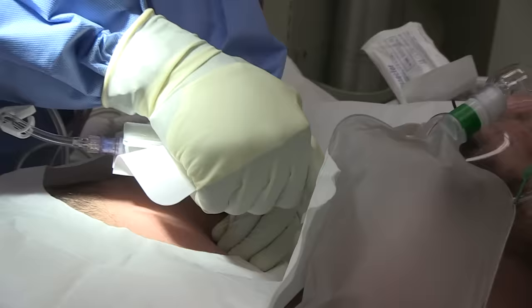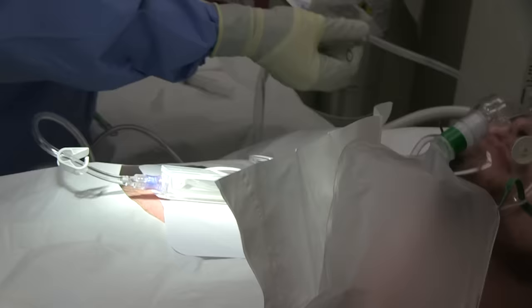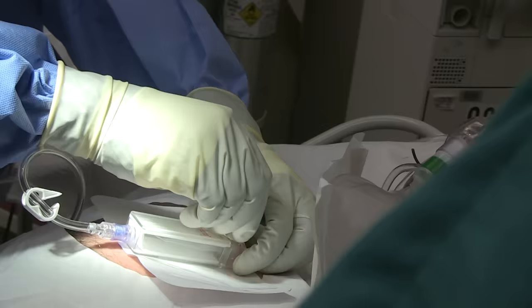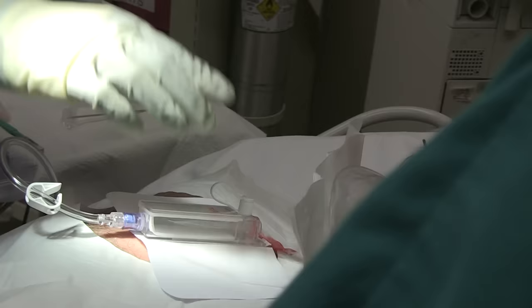And then it's connected. Patrick, you doing all right? Can you pull that paper back just a little bit? Squeeze as hard as you want. We remove our trocar and close the stopcock. Doing all right, Patrick? Yes, sir. Okay. Tell us if you're feeling bad. And that is essentially it.